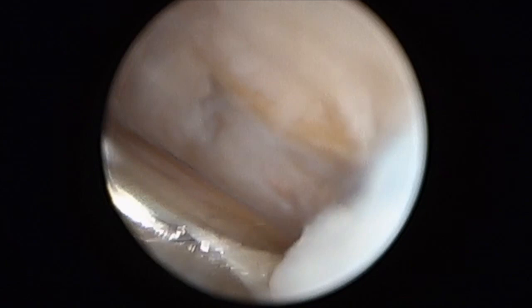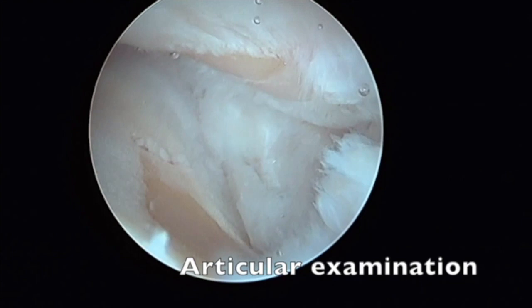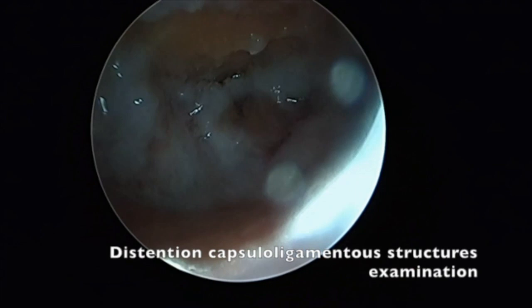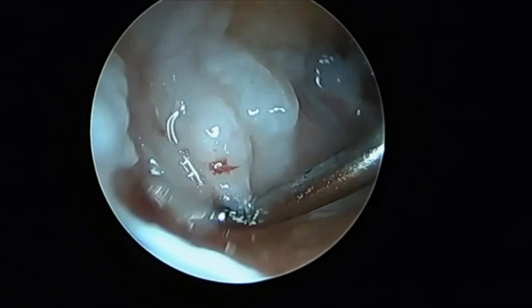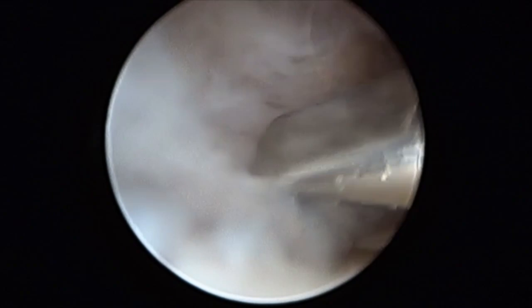Here you can see a bipolar arthritic lesion with some healthy cartilage around. A probe can be used to check the integrity of the ligament and to detect distension of the capsuloligamentous structure and the presence of intra-articular osteophytes. The ligamentous structures of the joint are addressed with a shaver without being too aggressive.